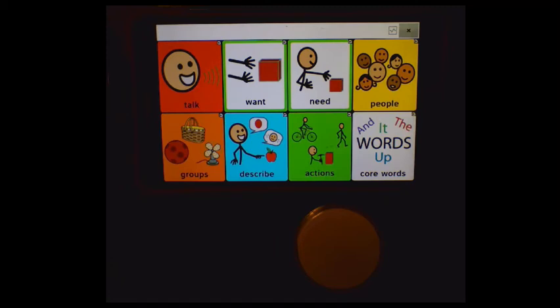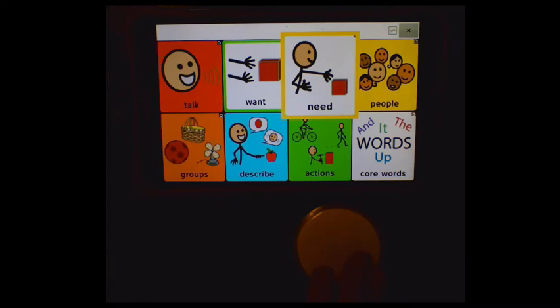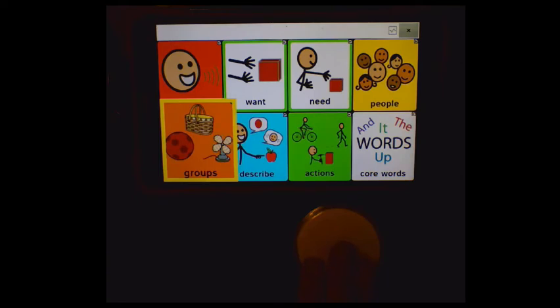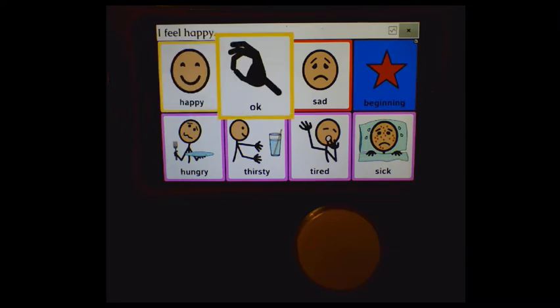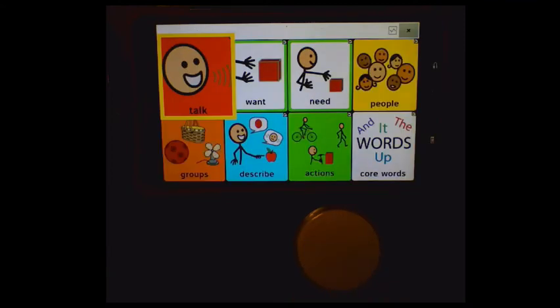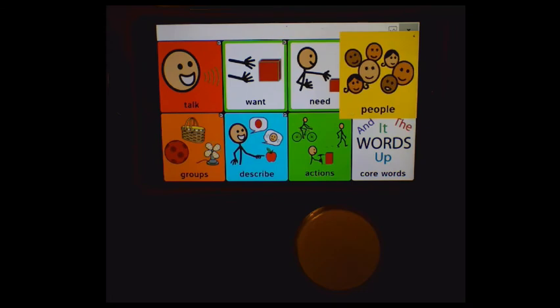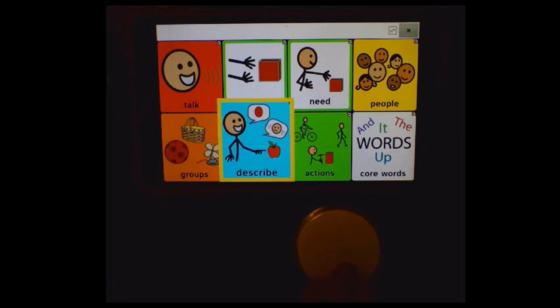The categories include Talk, Want, Need, People, Groups, and Describe. In the Describe category, there's 'I feel' with options for Happy, Okay, and Sad. The scanner cycles through Talk, Want, Need, Groups, Describe, and Actions.